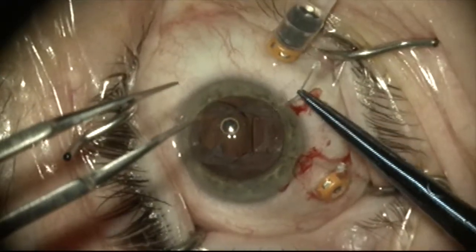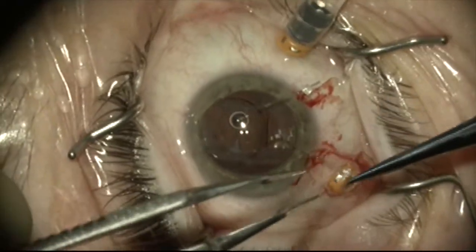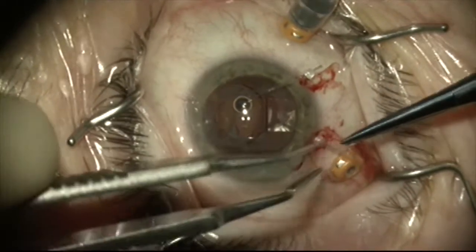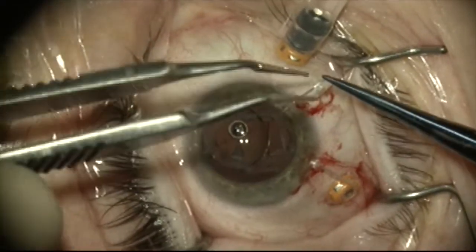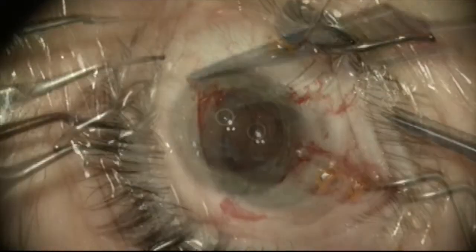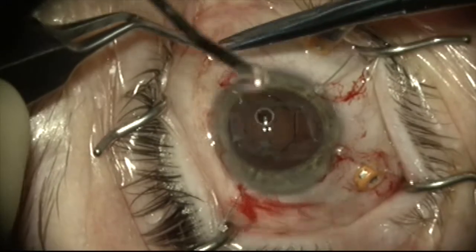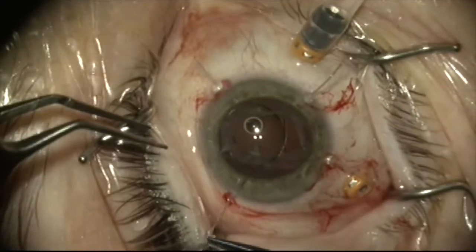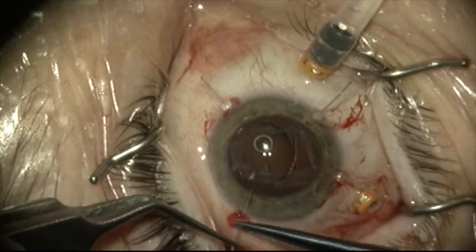Now I'm going to place iris retractors to hold the anterior capsule rim. This will serve two purposes: it'll expand the anterior capsule opening to help me prolapse the lens up through the anterior capsule, and it'll stabilize the complex so that I'm not transmitting as much of my manipulation forces onto the remaining zonules.